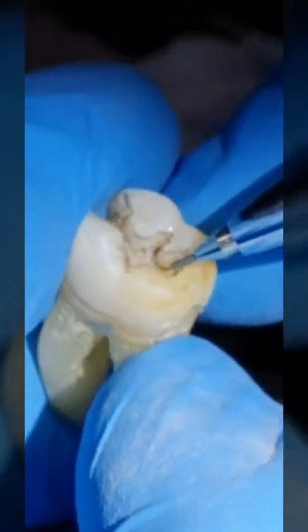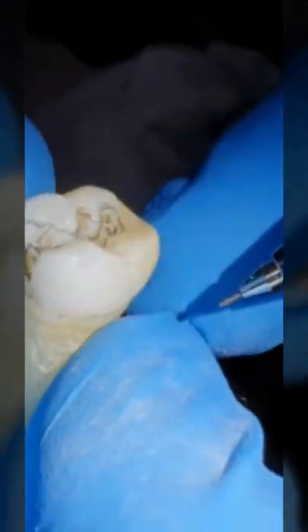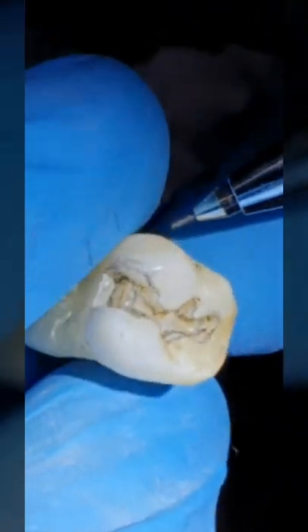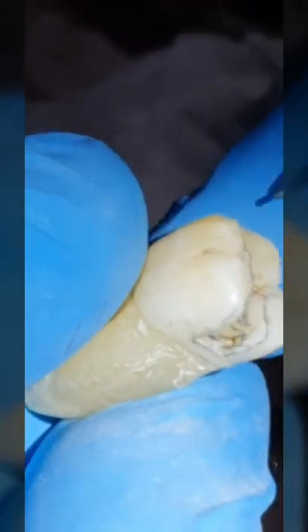Then we'll convert it into an MOD inlay, then we'll convert it into an onlay, then we'll convert it into a 3/4 crown, then a 7/8 crown. A 7/8 crown would involve the distal aspect and leave the mesial facial aspect of the crown of the tooth intact. Then we'll convert it into a full crown.